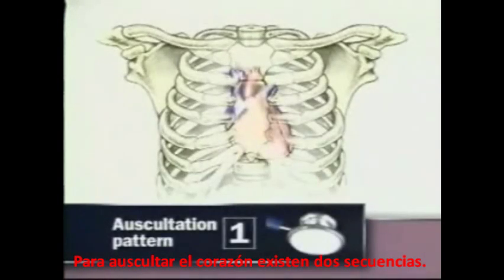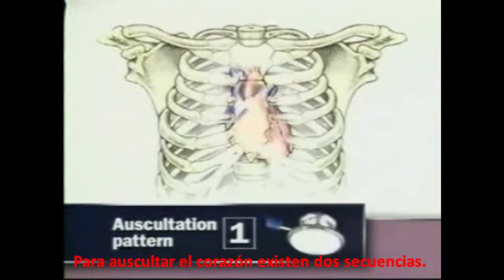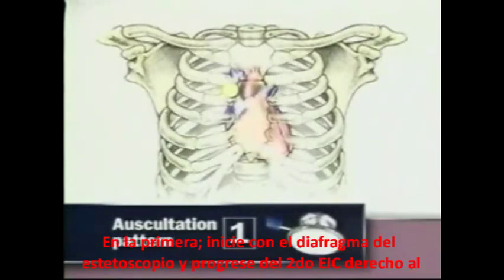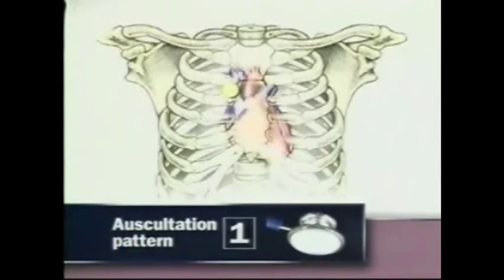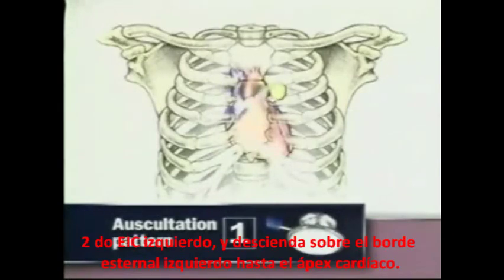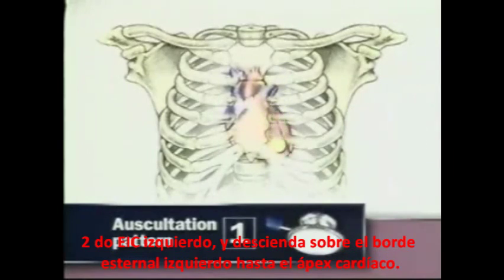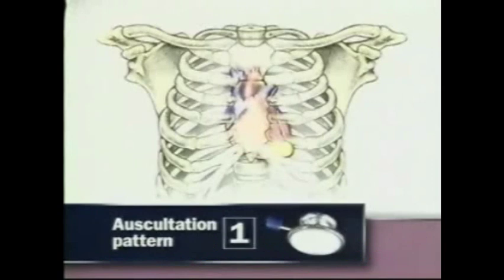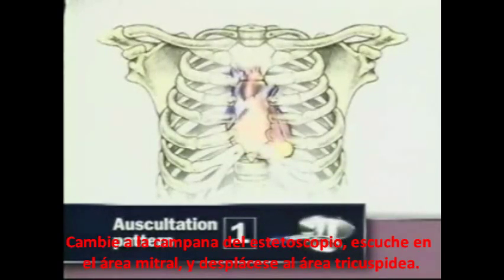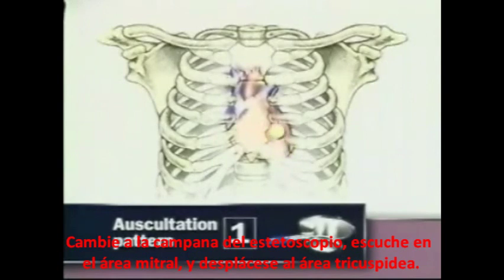For auscultation of the heart, you may choose between two sequences. In the first, start with the diaphragm of the stethoscope and progress from the right second interspace to the left second interspace and down the left sternal border to the apex. Then, with the bell of the stethoscope, listen again at the mitral and tricuspid areas.